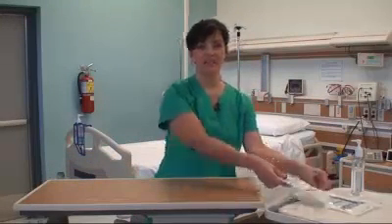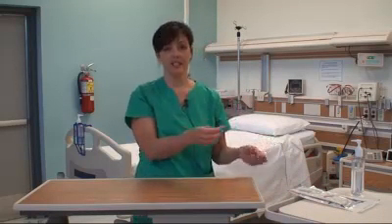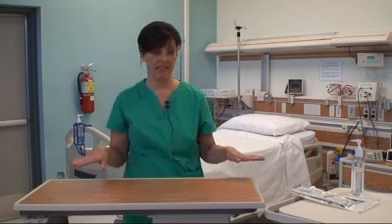I'm going to demonstrate how to don sterile gloves. Before I do that, I'd like to make sure you're aware that you first disinfect your work area, and I have already done that.